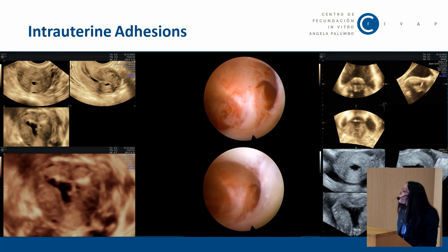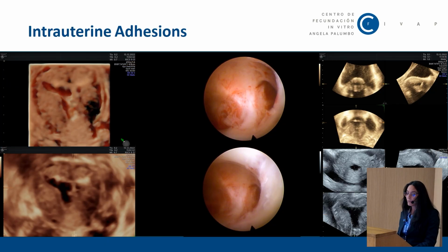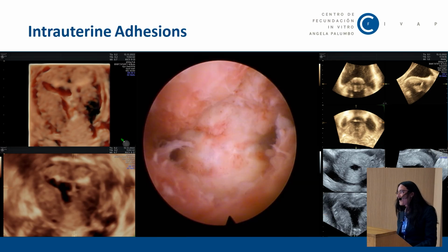Another case where ultrasound guidance is important is during embryoscopy for miscarriage, but I don't show any cases because tomorrow Dr. Rouleau will present the new technique. And sorry for the video.